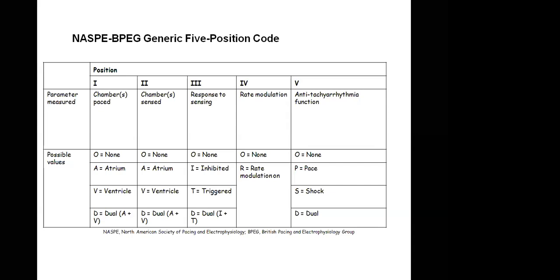Okay. So let's say a normal PR interval uses a time of 200 milliseconds, and you say, I want to allow intrinsic QRS, so let me make it 250 milliseconds. At the time of 250 milliseconds, if I don't sense an intrinsic QRS, then I must pace. Okay, so that's how it is programmed. And if you sense, you don't need to pace. Yes, if it senses, then you will not need to pace. Okay, thank you.